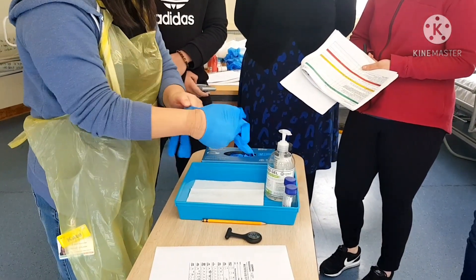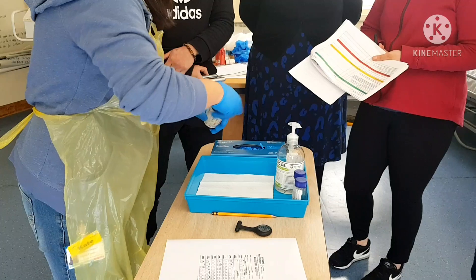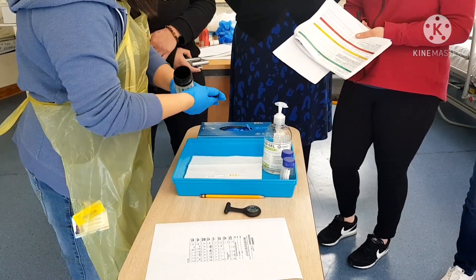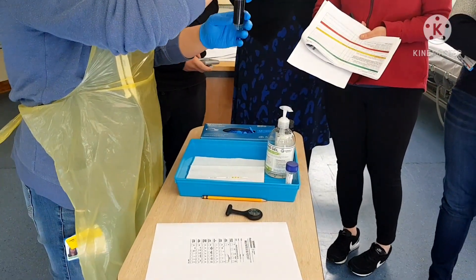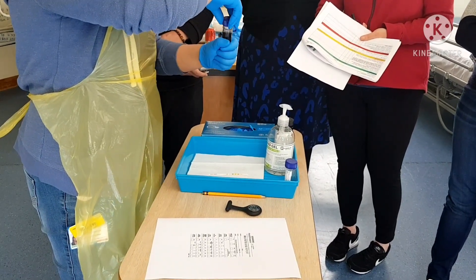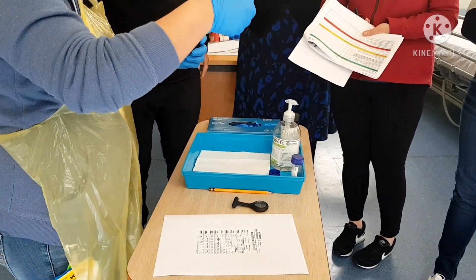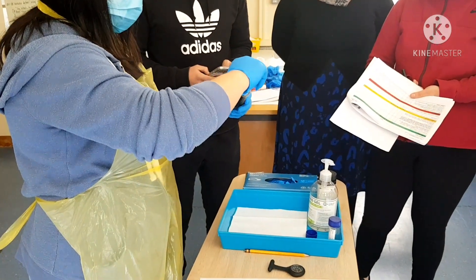I'm going to wear my gloves. I am going to take one strip, making sure that I don't contaminate the area where I'm going to dip the urine. I'm now going to take my urine sample, making sure that it's properly labeled. Mr. Assessor, can I please have the watch, because the wall watch isn't working? Yes.